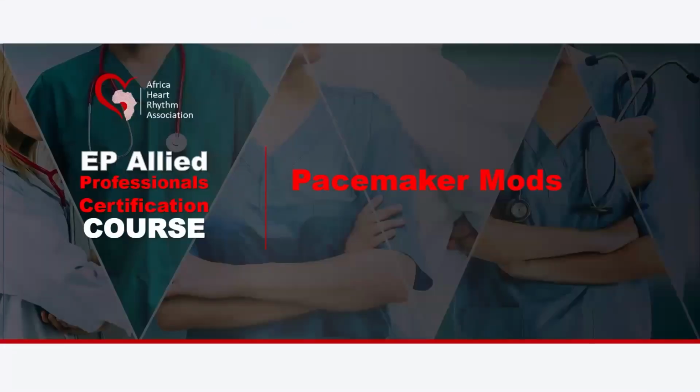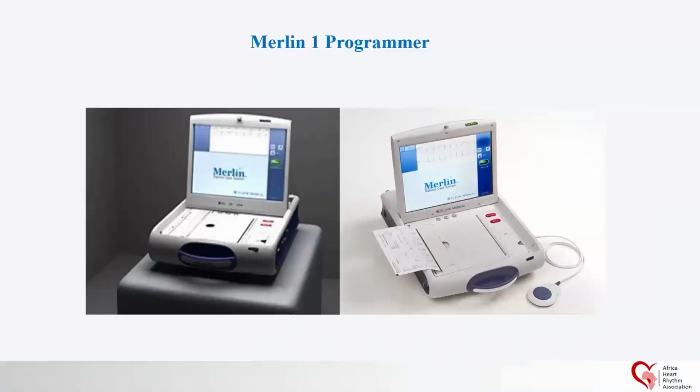Okay. So now I will talk about pacemaker modes. It's very important also. But before that, we will talk about the program because during the implementation, during the procedure, we will use this program to place the leads and also during the follow-up. That means we need to check the device if all is good with the device.